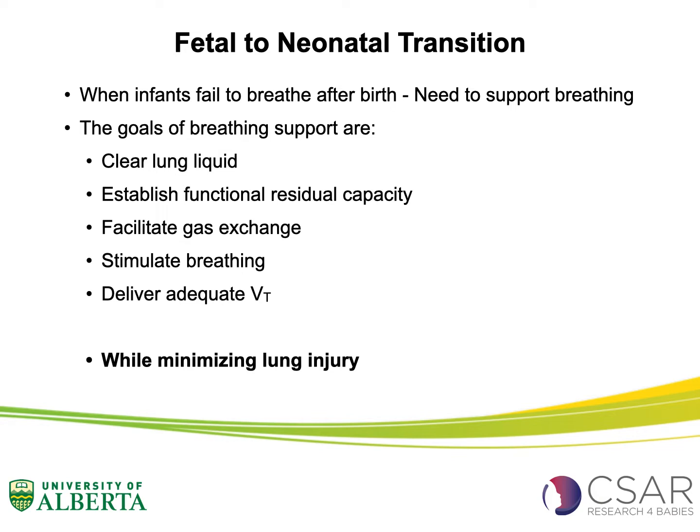Now, when infants fail to initiate breathing, the goal of the breathing support is the same as what the respiratory transition would do. With the breathing support, we have to clear the lung liquid, establish functional residual capacity, facilitate gas exchange, and stimulate breathing, by also delivering an adequate tidal volume. Whenever we do this, we have to find ways to minimize lung injury.